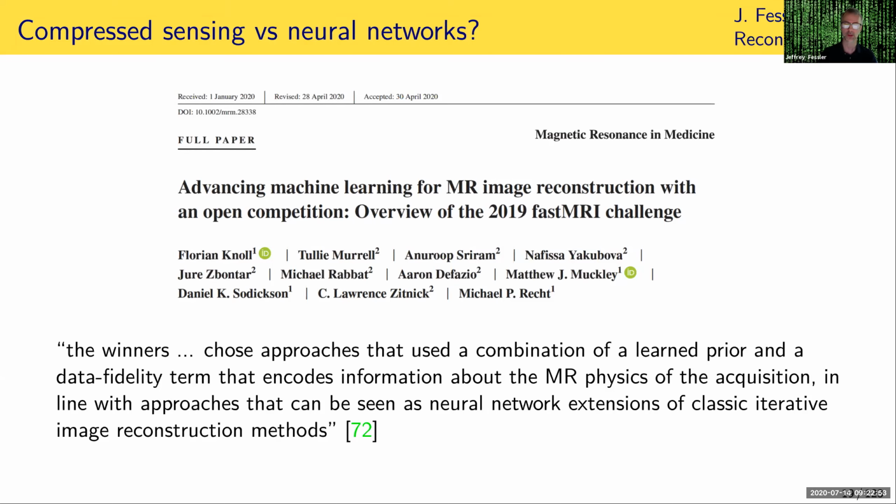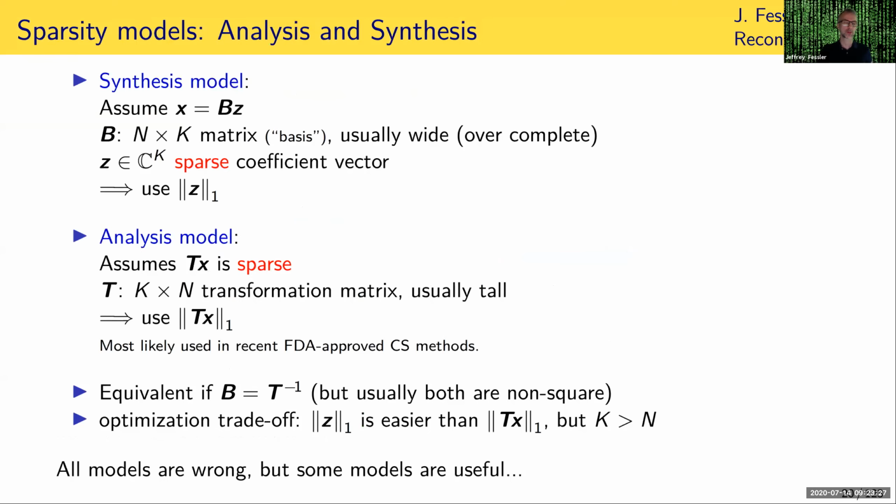iterative image reconstruction methods. And in fact, those of you who might have attended Friday's tutorial on advanced reconstruction methods, that was also a prominent theme in that tutorial, that combinations of machine learning and iterative algorithms, unrolled loop kinds of algorithms that I'll be talking about as well, are the state of the art, I would say, in image reconstruction. And I think to understand that state of the art, you need to understand the iterative algorithms even for, say, classical compressed sensing now. So I'm going to spend some time on that before we get to the truly adaptive methods.